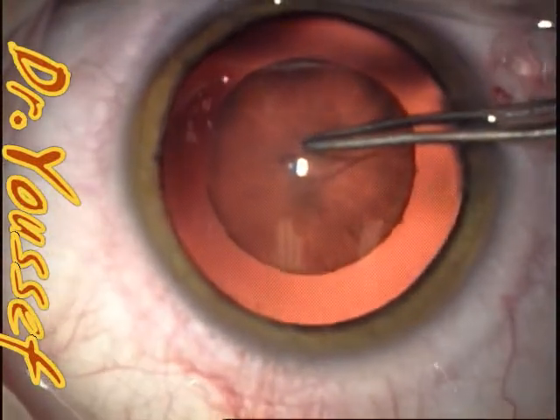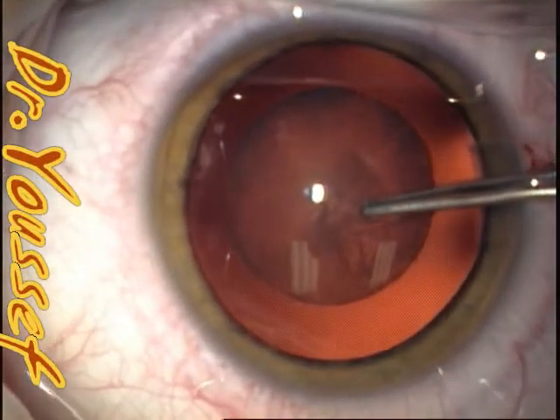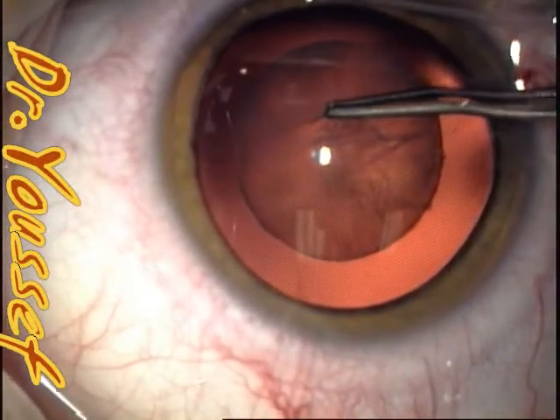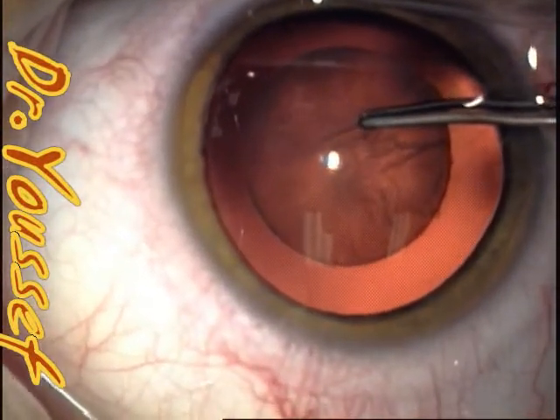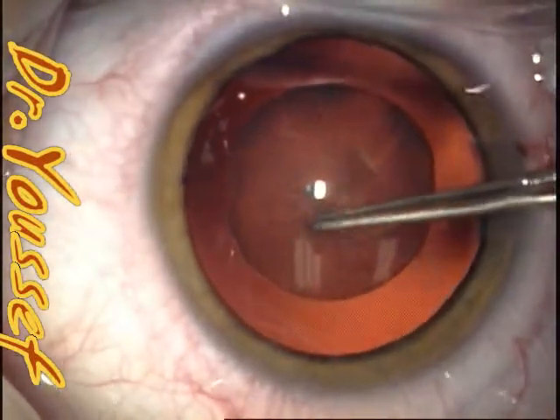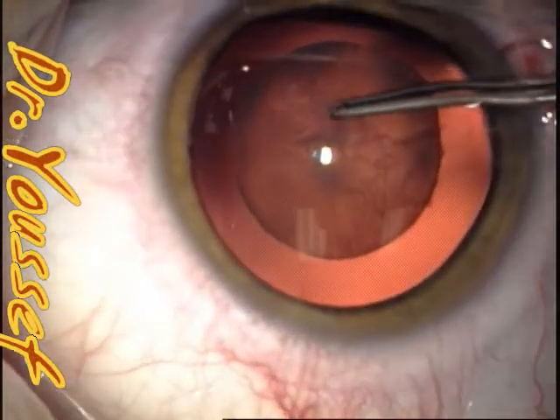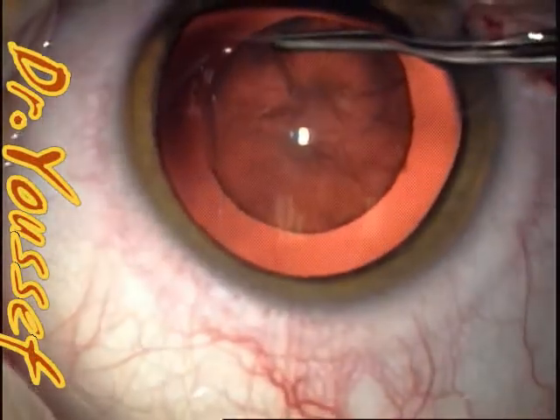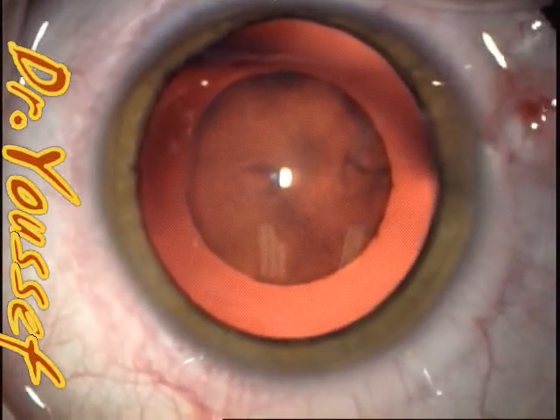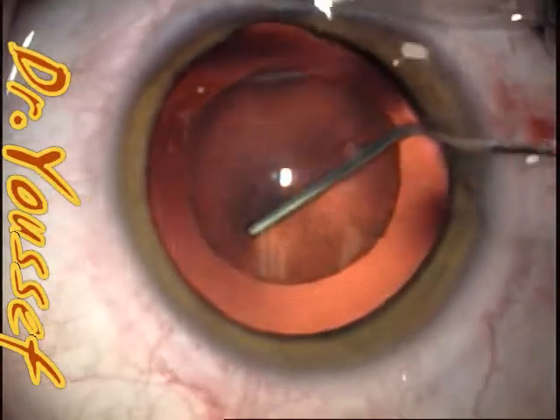This is the most tricky part of the cataract surgery in a six-year-old. Implanting the lens here as standard — because the patient is six years old, we target about plus one. There's a curve for where you should target your refraction, because with time they get myopized a little bit. So you calculate the intraocular lens implant following that curve. It should be plus one for this age.